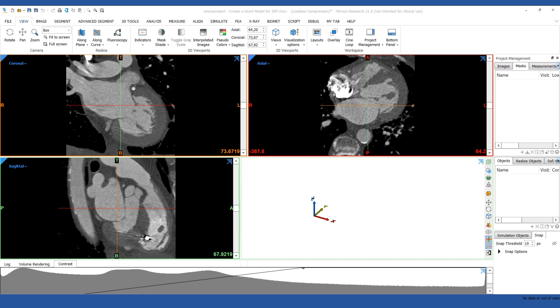We'll start from the initial segmentation of the DICOM images and work our way through to exporting the STL file that is sent to the printer. The most efficient workflow will heavily depend on your images, what you want the final model to look like, how the model will be used, and even what printer and printing technology will be used. The more of this information you have at the beginning, the more you'll be able to reduce unnecessary work.